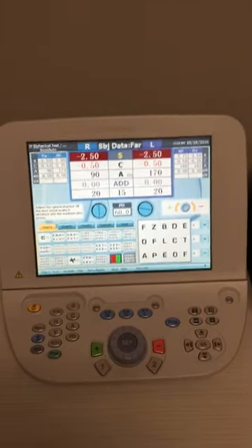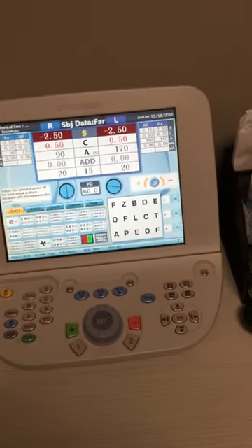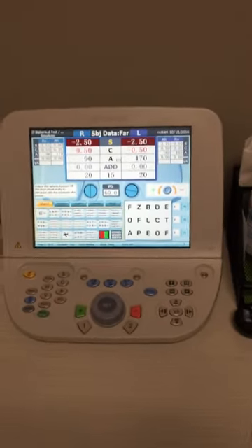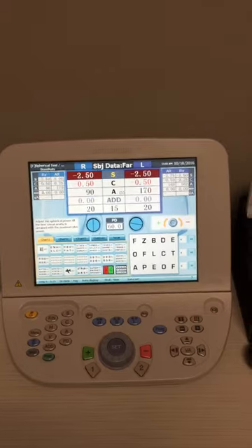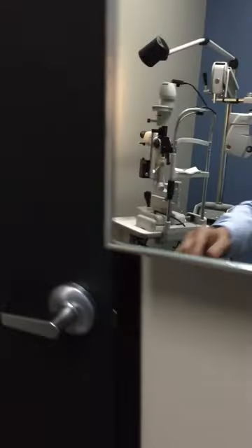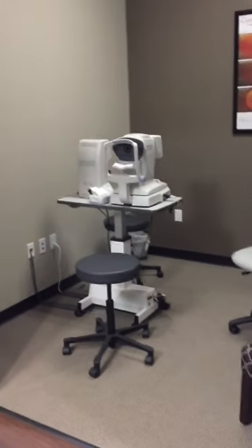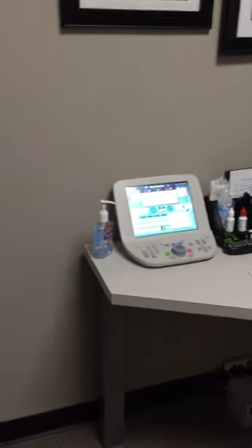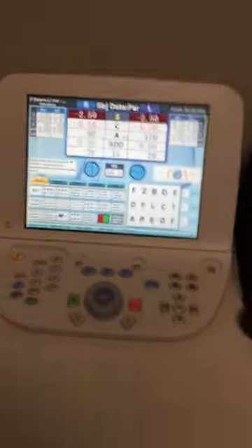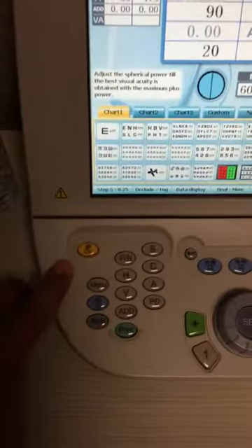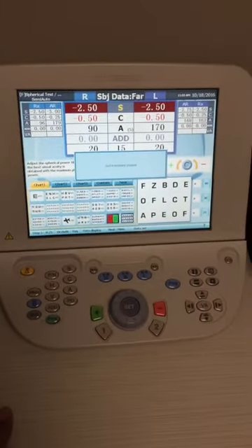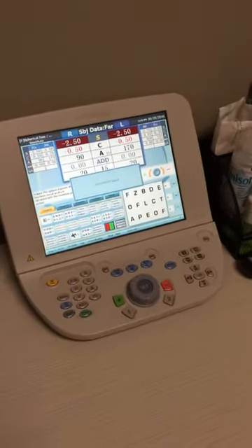I wanted to start off and show you the central unit here. The first thing that happens is that the receptionist or the optician is going to work up the patient and get some auto refractive readings as well as auto lensometer readings in the pre-test room, which is over here. Once they take those measurements, they can transfer that information electronically to the system. If they don't, the first thing you need to do is clear out whatever information is here by pressing this clear button CL, and you'll hear all these lens changes from the phoropter unit behind me — it's just clearing everything out.